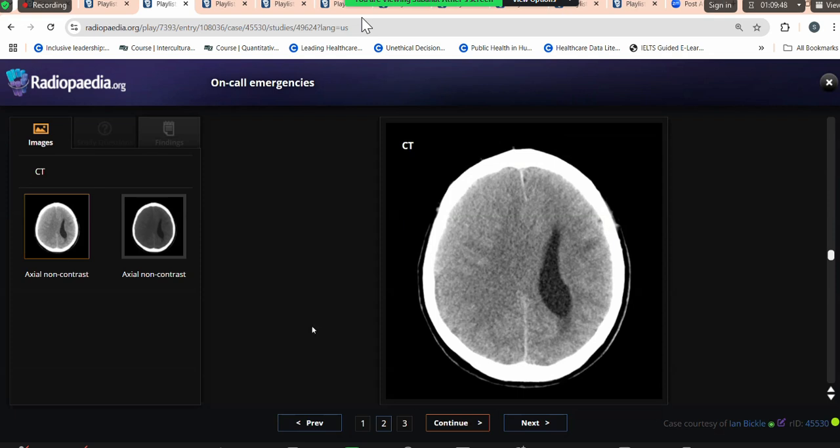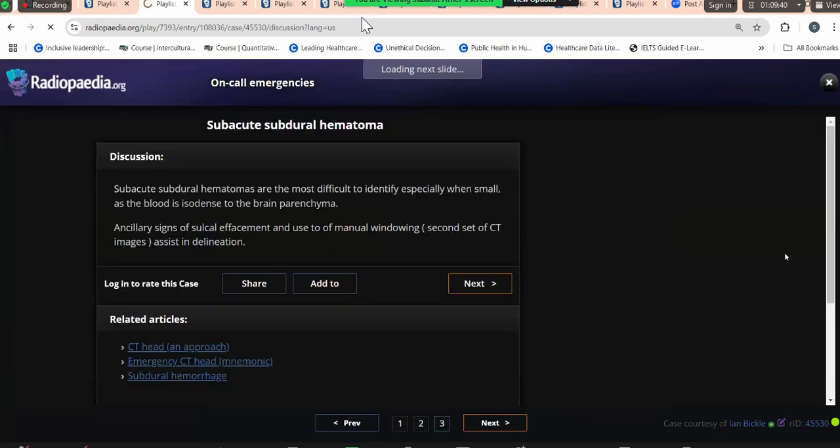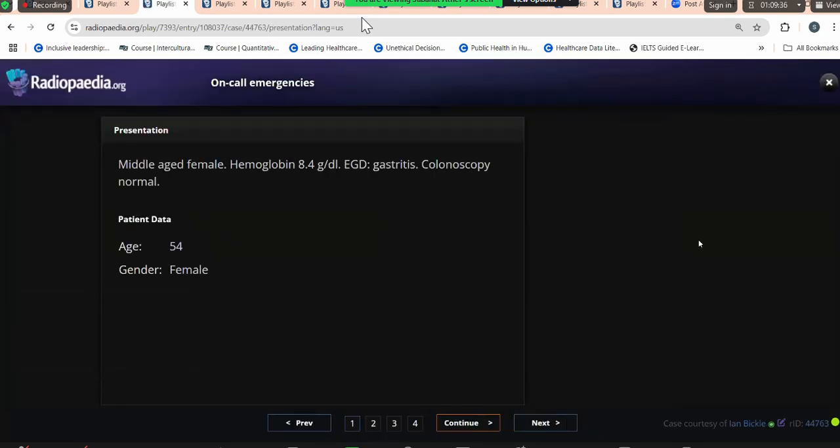Can you hear me, ma'am? Yes, I can. Just wait. Stop, candidate one. I just now clicked on the screen. Yes, click on the screen, not on the bottom, because it went to the next case. And there would be a sidebar at the side. Let me try. Actually, I cannot see this sidebar. Okay, just wait. Let me help you out here. If you can leave the mouse, let me see what I can do. Is the sidebar visible to you now? No, ma'am.